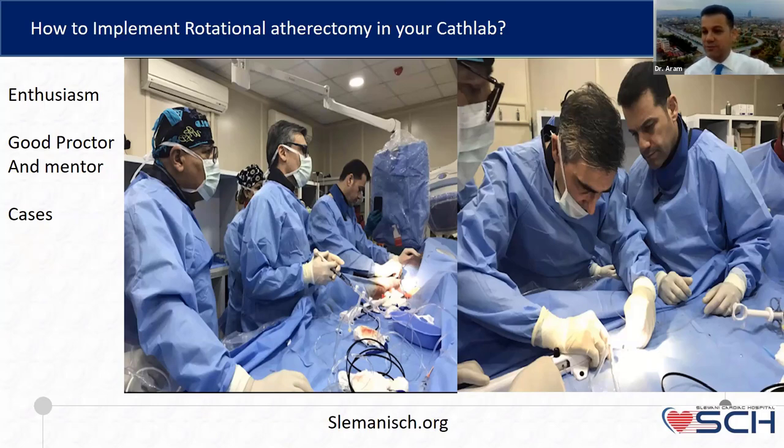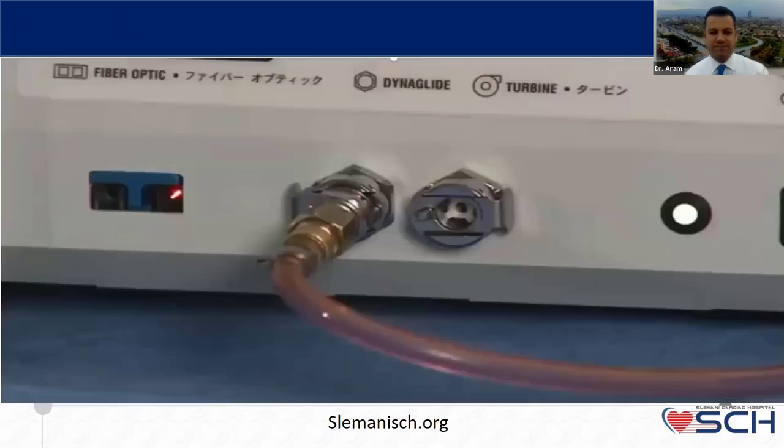So if anybody has a wish or enthusiasm to start with the rotablator, I advise him to call Dr. Amjad, to phone him and say: Dr. Amjad, I have brought a device, please come with me, teach me how to start it. And you should pick cases that are easy in the first 10 or 50 cases, just to improve your learning curve.